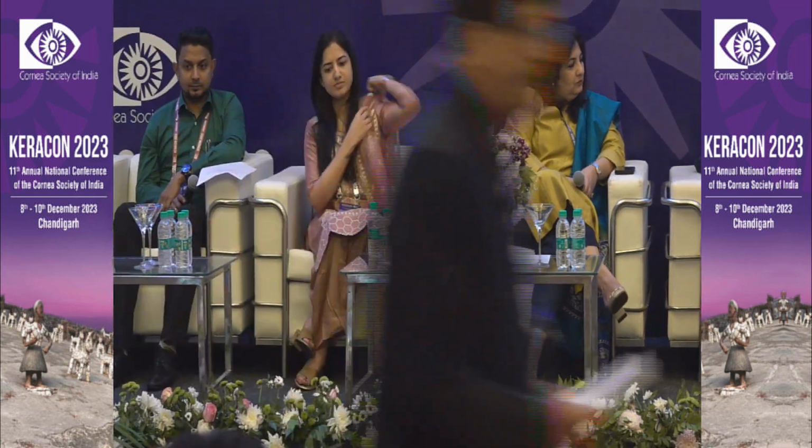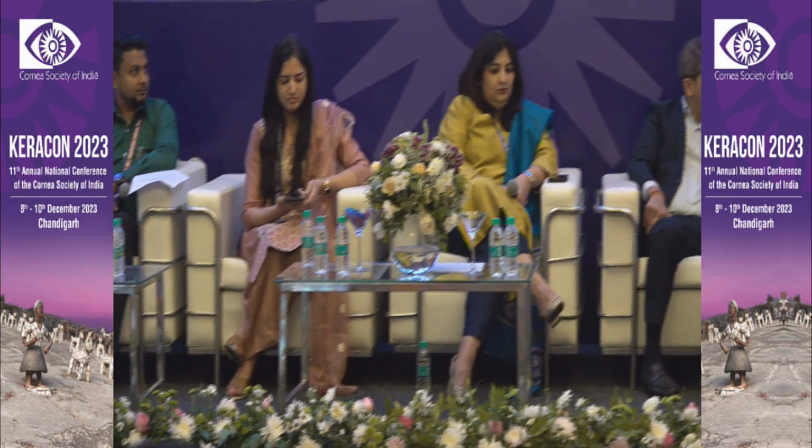It's like without topography we can't make do. I don't think corneal biomechanics is like that at the moment at least. At this point of time, it's not a mandatory test. But obviously, if you have doubts, then you have to take a call whether you want to be safe by getting the test done in a center close by which has the machine, or talking to your patient that, okay, we would reassess you 6 months down the line and then take a call, look at a couple of repeat imaging to see if there's any change.